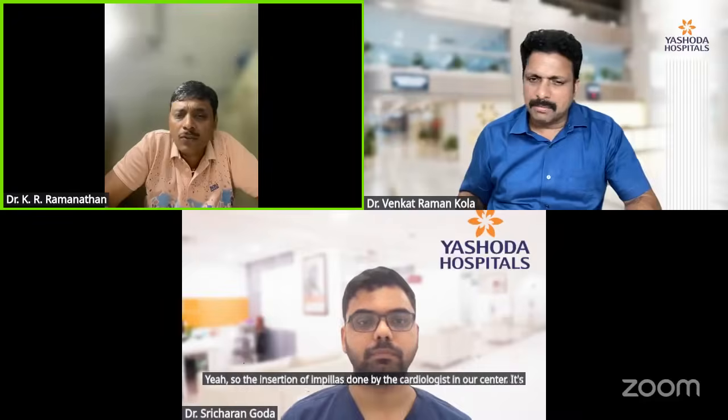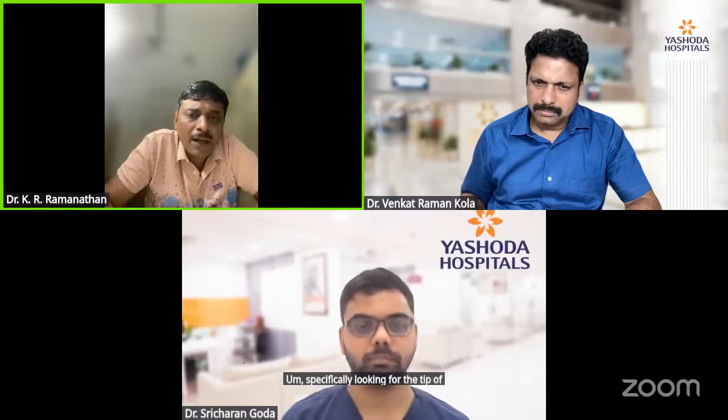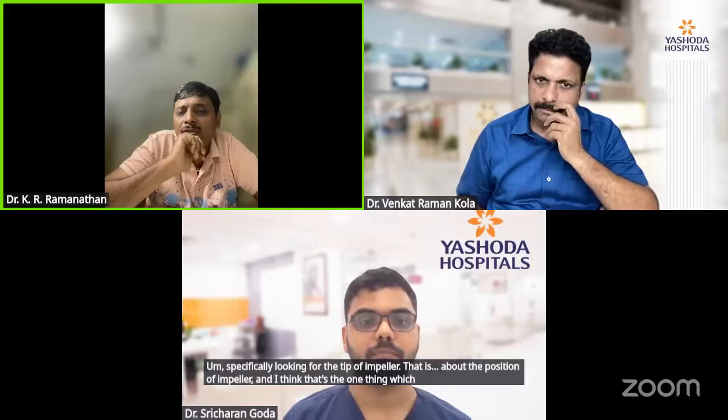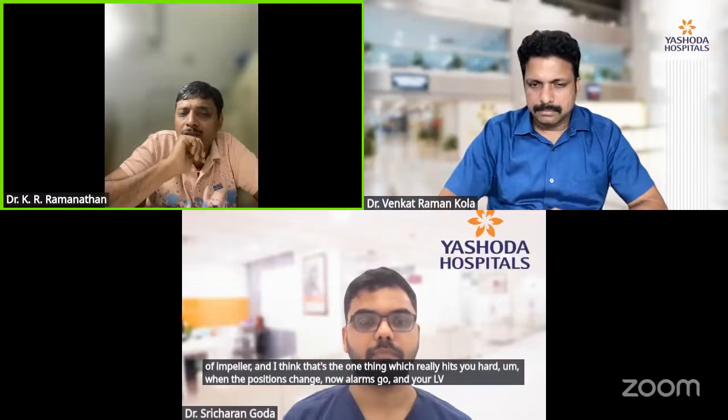It's done under fluoroscopy, and subsequent management happens in ICU, where our patients are serially monitored on 4-hourly echoes, specifically looking for the tip of Impella. That is about the position of Impella. And I think that's the one thing which really hits you hard. When the positions change, the alarms go, and your LV venting is not good enough.